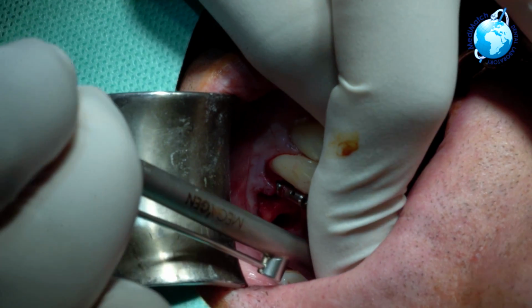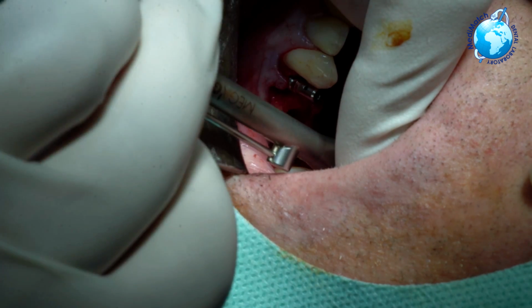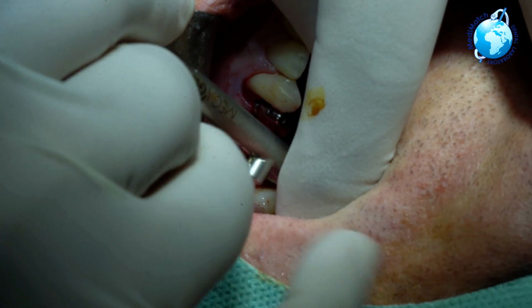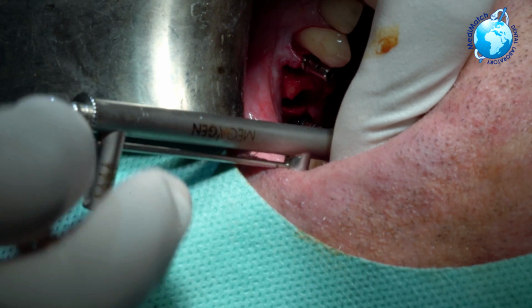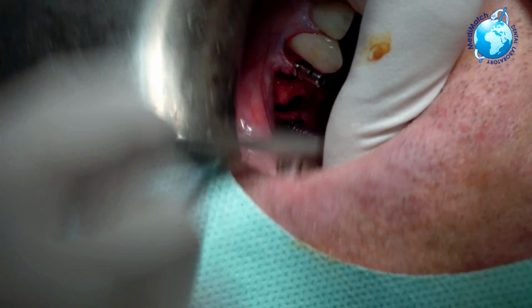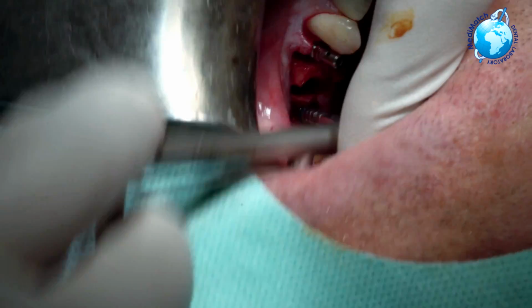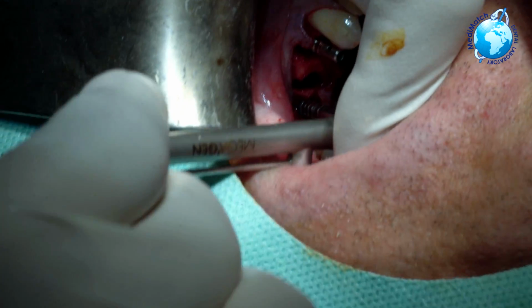Right, so I'm just going to relax that fit a little bit because it's nice and tight. Just going to take it out a wee bit. Just going to wait. Bone has the property of being viscoelastic, so it does adapt. And I'm going to go back in with this implant. Really nice and firm. I'm just a carpenter. See? There we go.